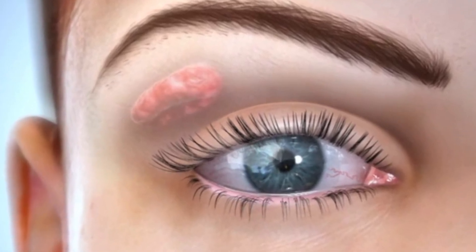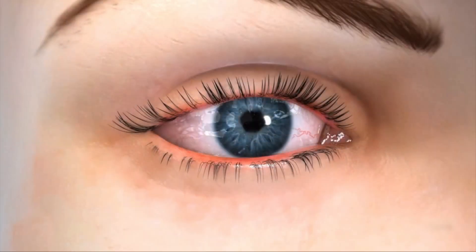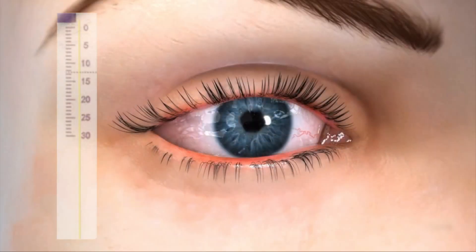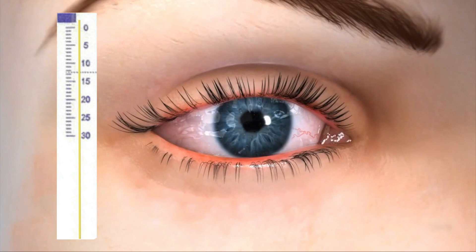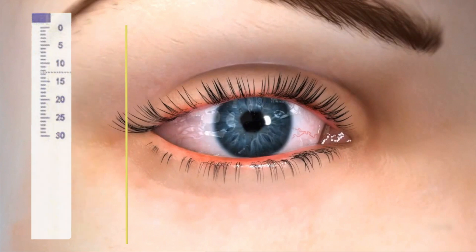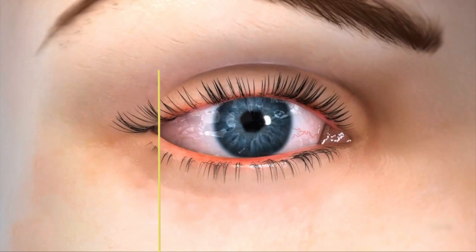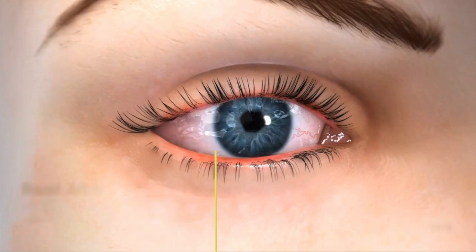The phenol red thread test is a basic measurement of aqueous tear production by the lacrimal gland. This test is an alternative to the Schirmer's test and is considered to be less irritating and faster to perform. No anesthetic eye drop is required.